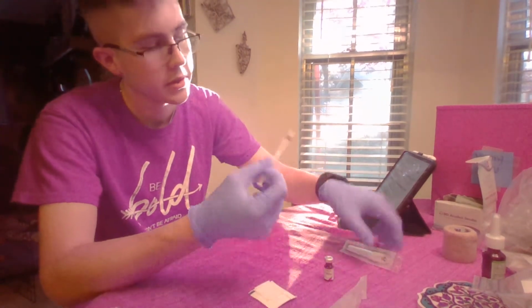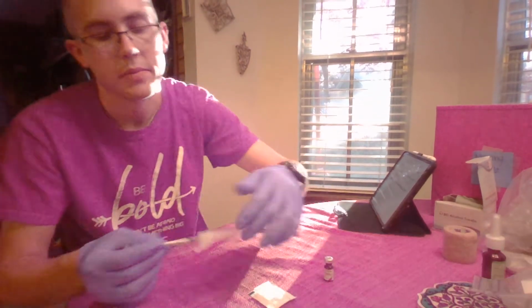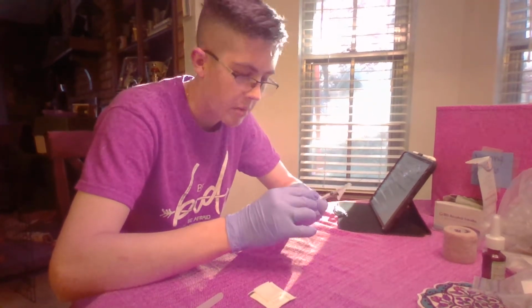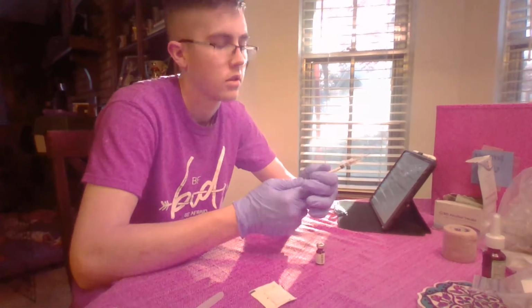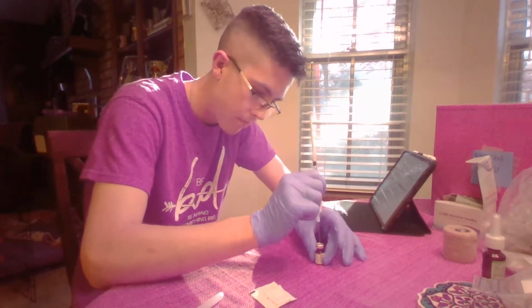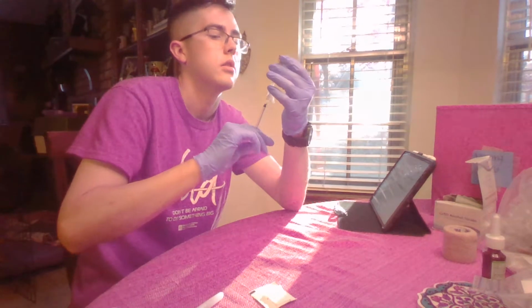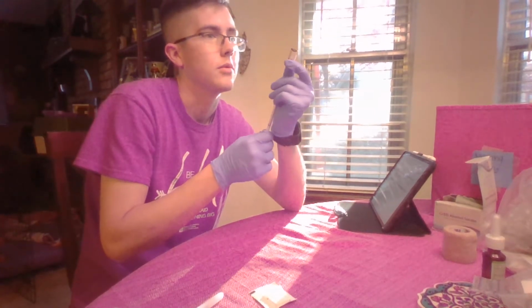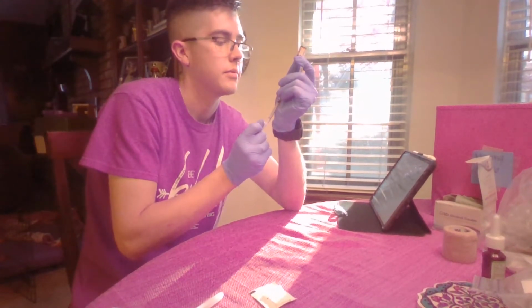Next, I will assemble my materials, make sure that I'm trying to do it as sterilely as I can. Recheck my medication, clean the top of it, pull back 1 milliliter of air. Inject it. Draw up my medication.